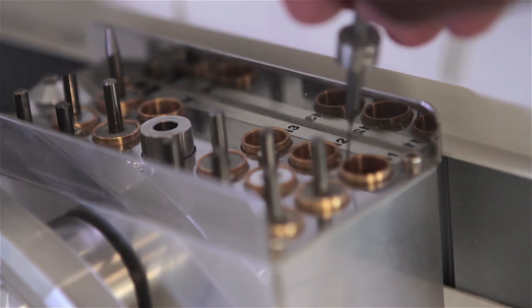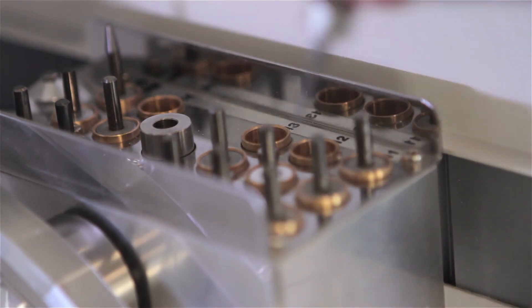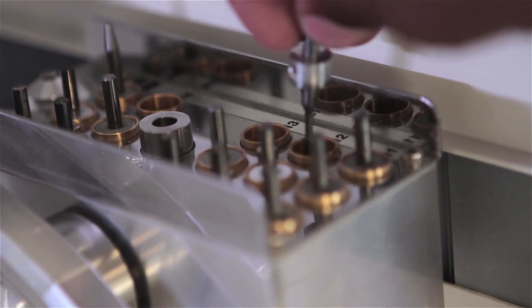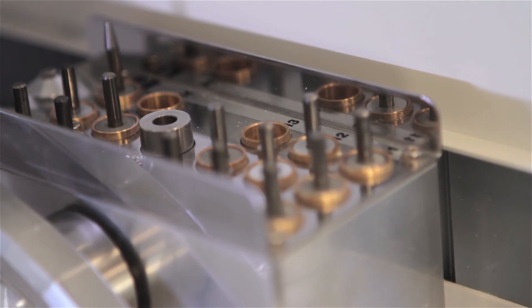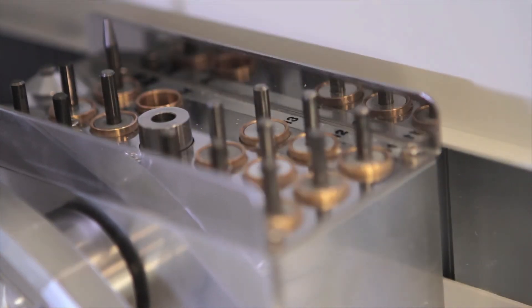The mill also comes standard with a high-capacity automatic tool changer featuring 15 stations for you to load a variety of diamond-coated, carbide, and Roland hybrid tools for continuous milling and non-stop production.